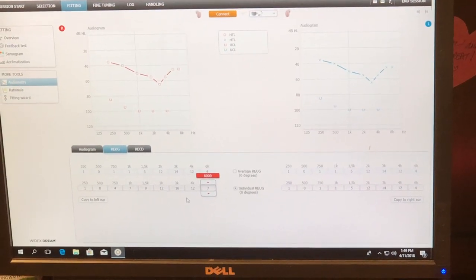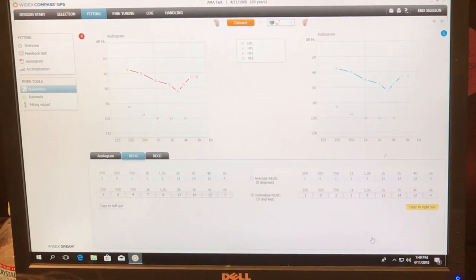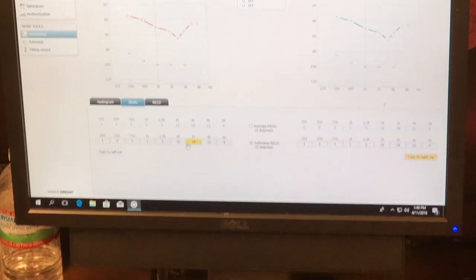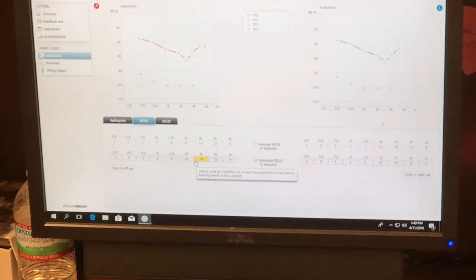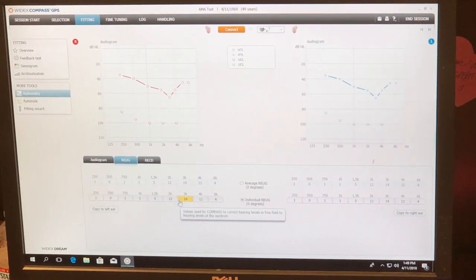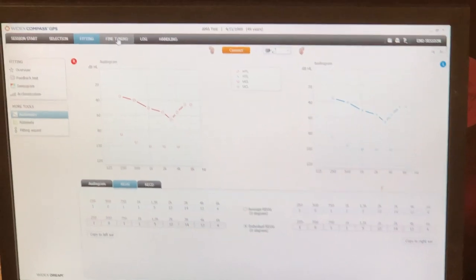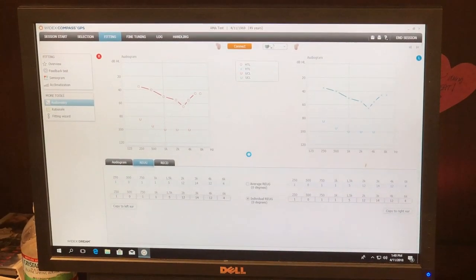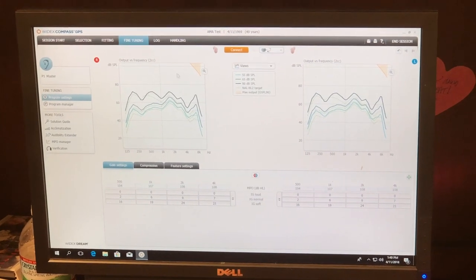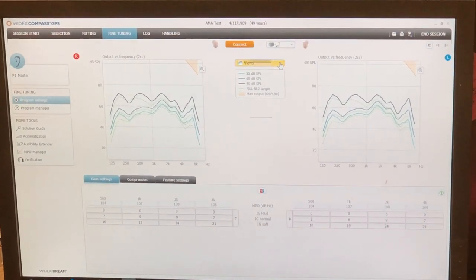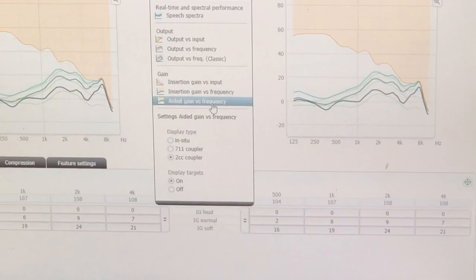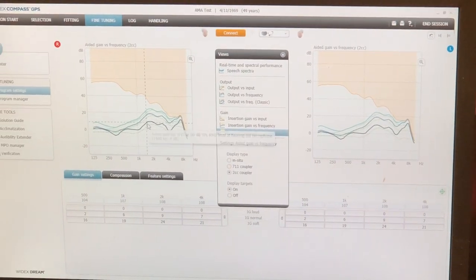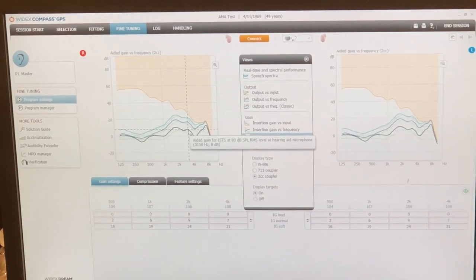Is this like the fine tuning? No. All I'm doing is I'm taking the ear canal resonance from my real ear system and putting it in your fitting. So now watch what happens to my fine tuning. And I want to go back and look at my gain. Look at that. It moved to this peak, this got higher. Wow.